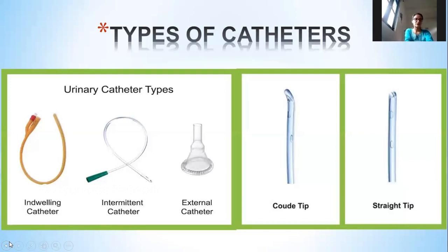We'll understand about this. Now, an indwelling catheter is nothing but a catheter which is going inside the urinary bladder, right? A common example would be a Foley's catheter, and you could see now it is having two lumens, right? One lumen is red and the other lumen is simple yellow, right? We'll understand about different parts of the Foley's catheter in the next slide.